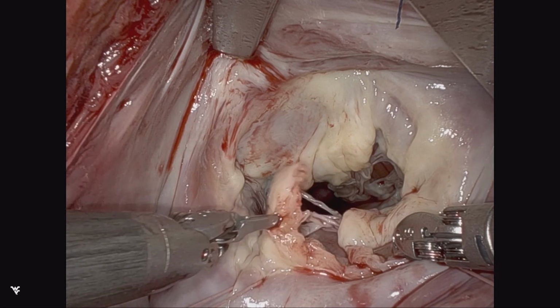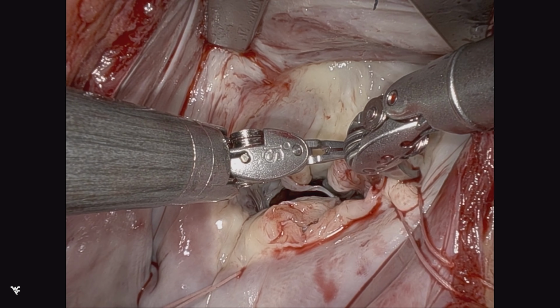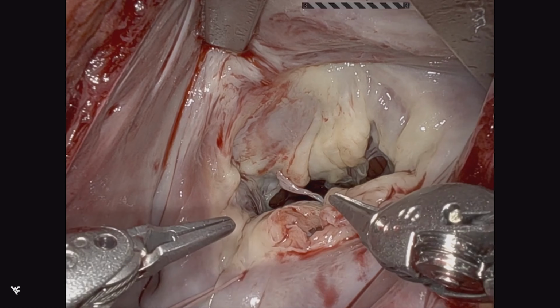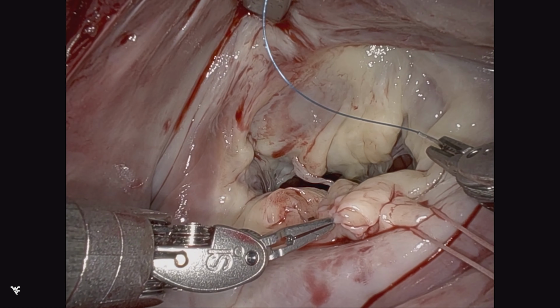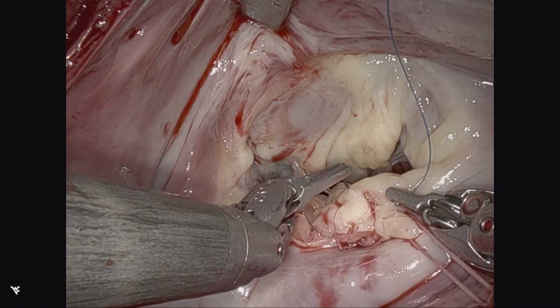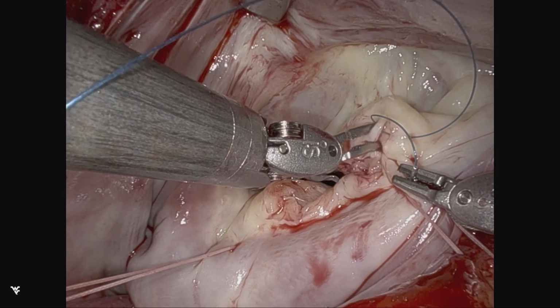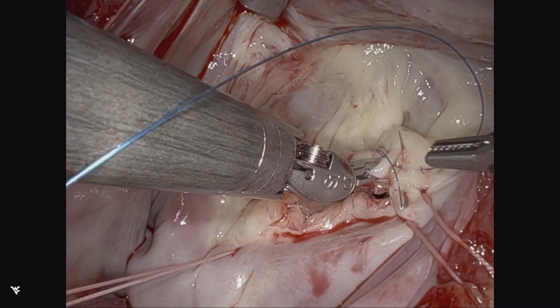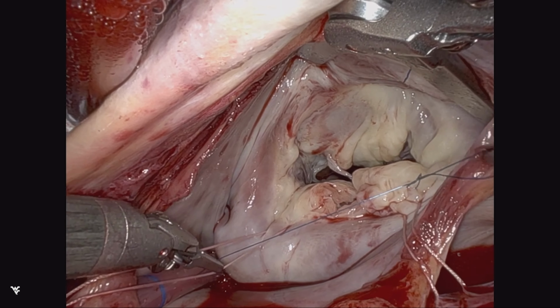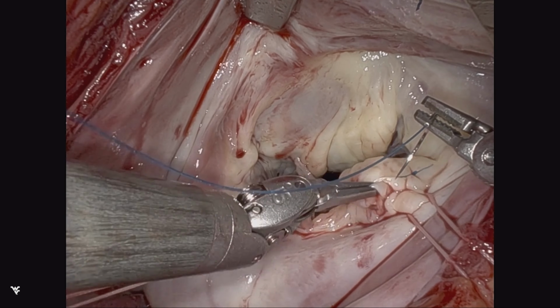And then bringing these two leaflets together while navigating that MAC. But the key thing is making sure that it aligns quite nicely. This is another nice demonstration of those retraction sutures being placed when more complex resection is required or even assessment is required. So the valvuloplasty is performed to the annulus, or at least to the hinge point, creating height reduction.